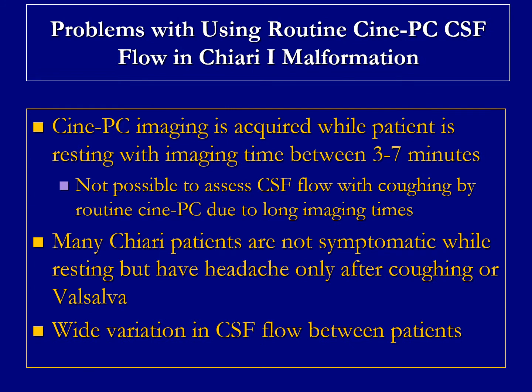So what are the problems that we were facing? Why were we thinking, after using so many years of routine cine phase contrast, that this is not a very good method to use? The routine cine phase contrast method is acquired while the patient is resting, with imaging time of between 3 to 7 minutes. You can shorten it, but still it could be about 1 to 2 minutes.